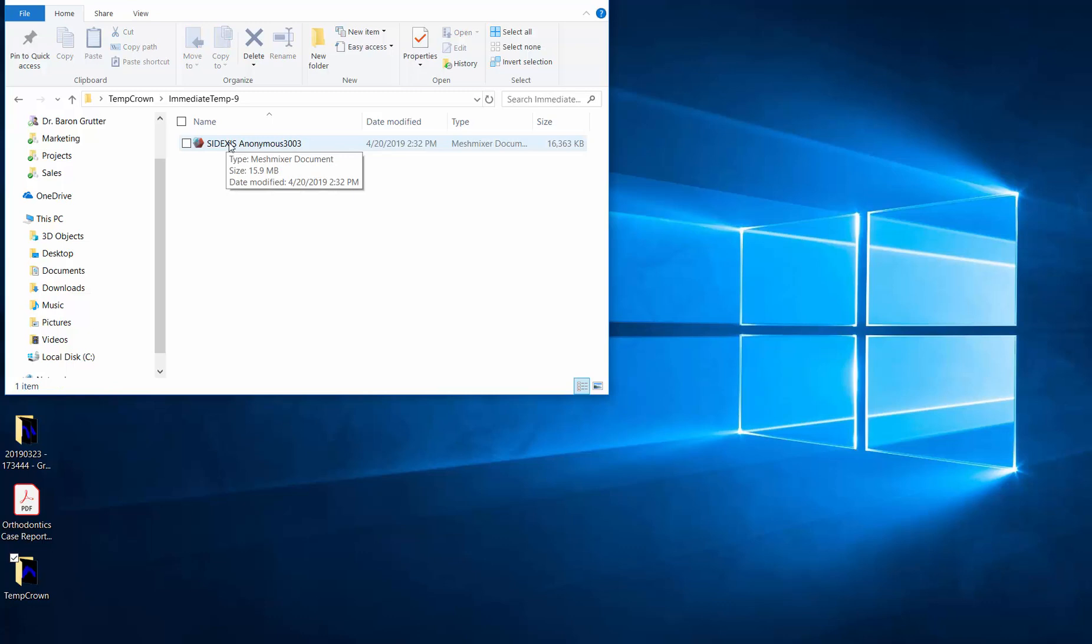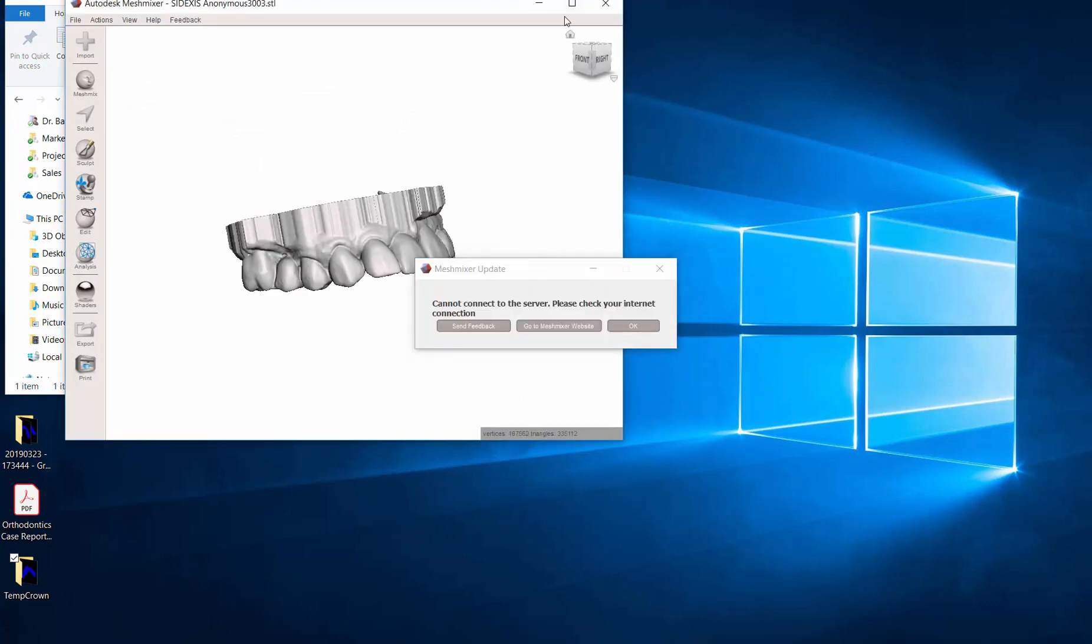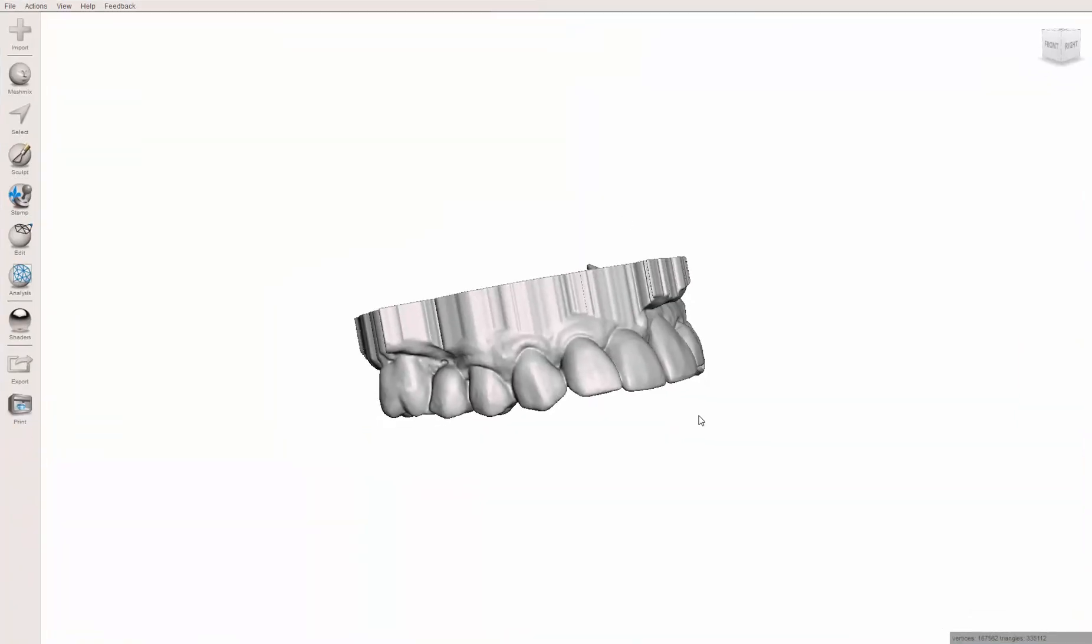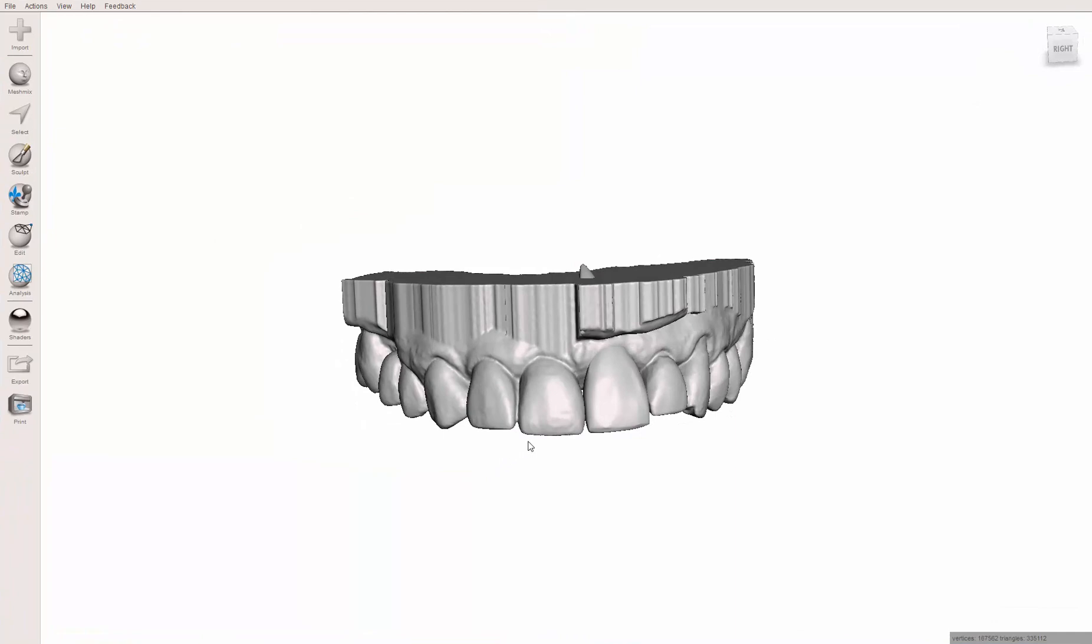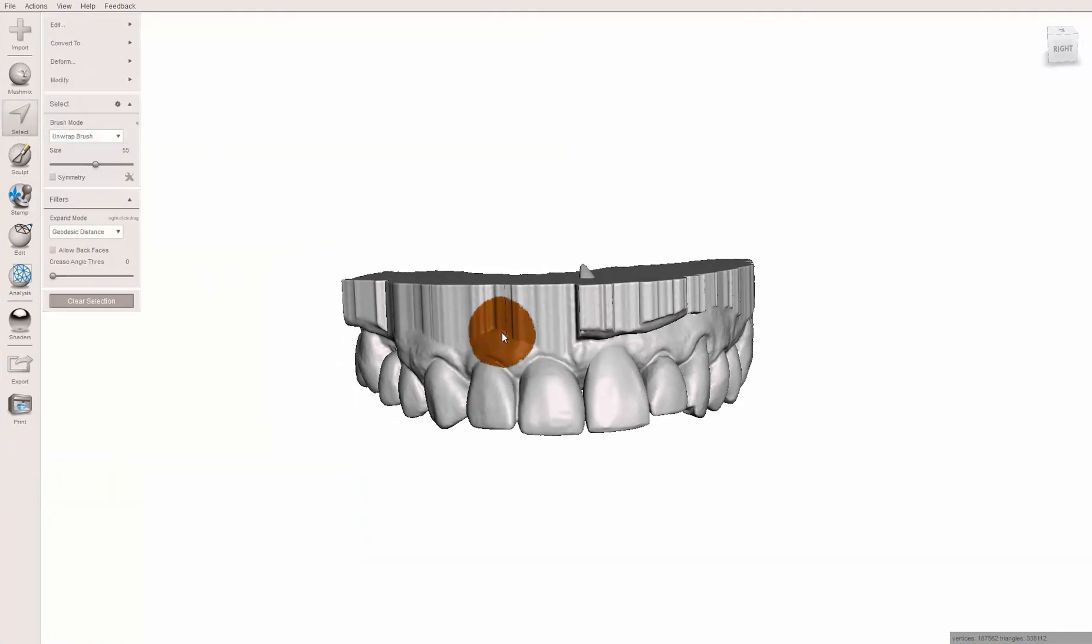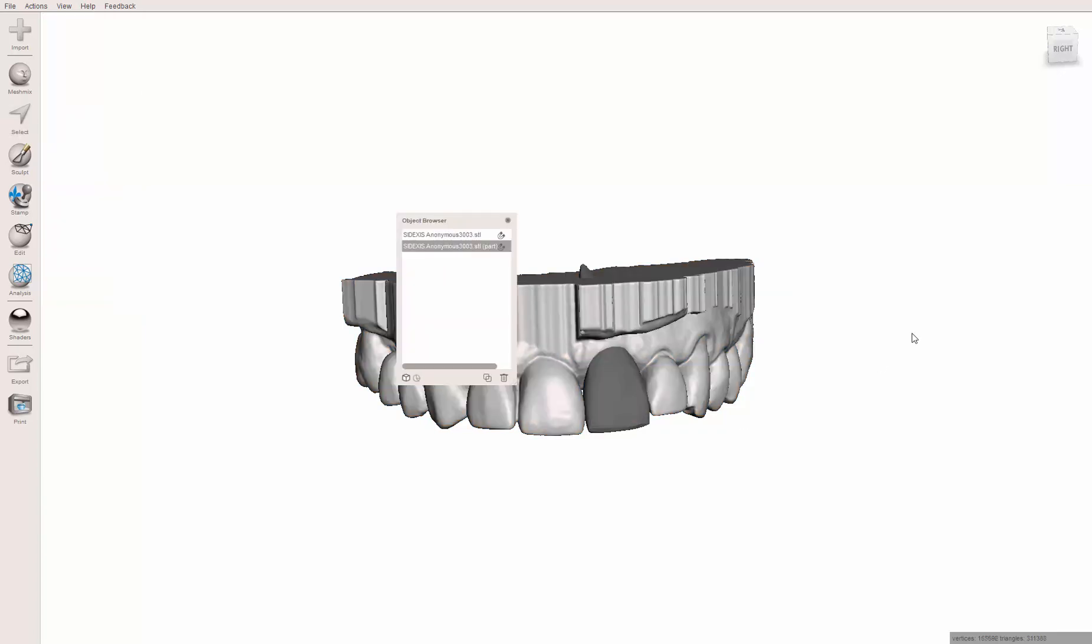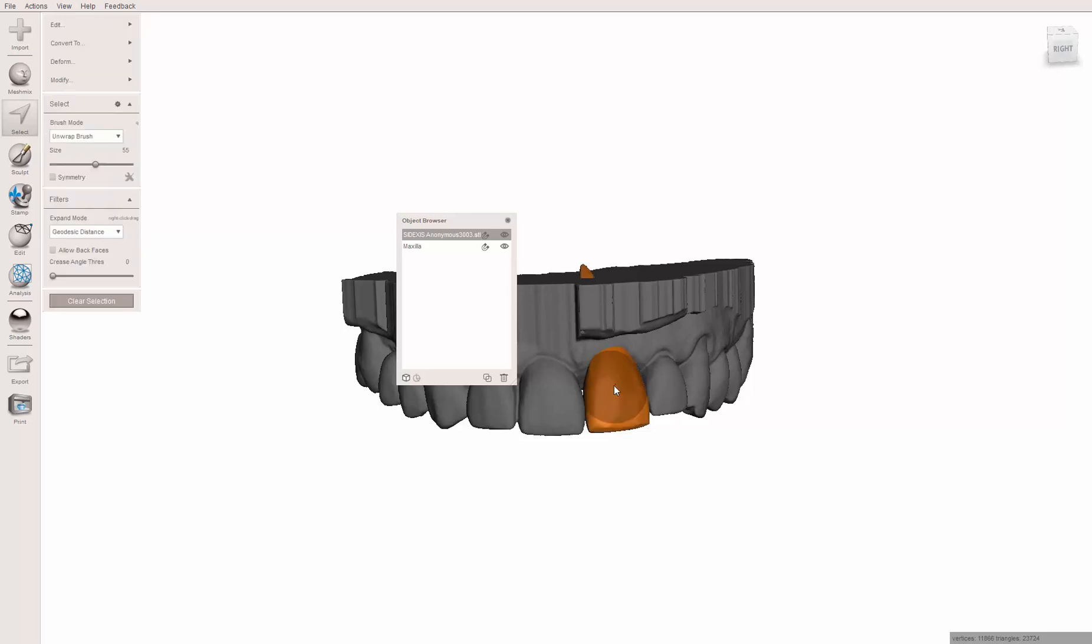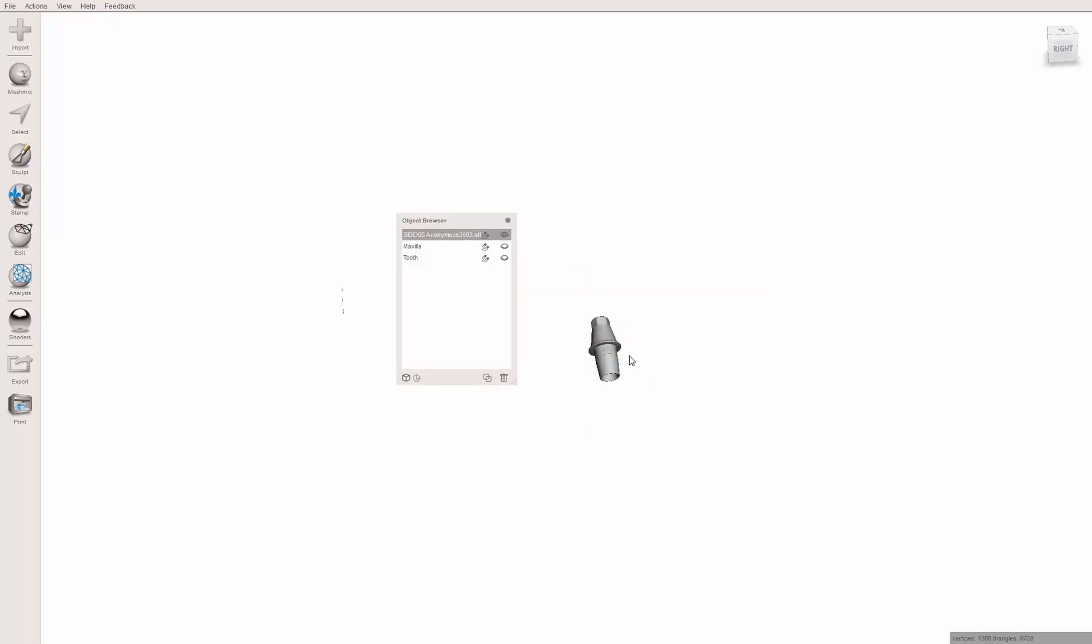Again, I could have exported them as three separate files. I'm not going to simply because I guess it's just a matter of preference. I've got one file here. I'm going to separate all three parts in here. If I didn't do that, I would just have to drag and drop them and bring them all into one file. So anyway, to show you what I'm talking about, I'm going to click on the S button or select, double click anywhere on the model. It selects the whole thing. I press the Y button that will separate it from everything else. Go ahead and rename that maxilla. Now this part actually has the tooth and the abutment. So I'm going to select, double click that. Y name that the tooth. If I hide both the tooth and the model, you see the only thing that's left is the abutment. So might as well rename that abutment.